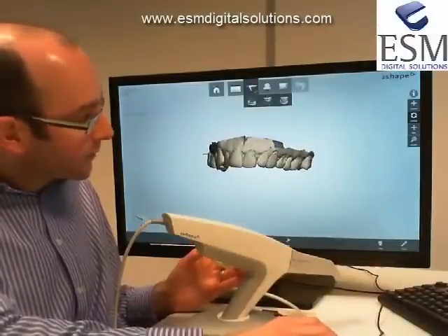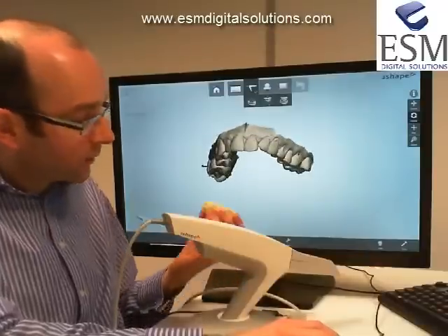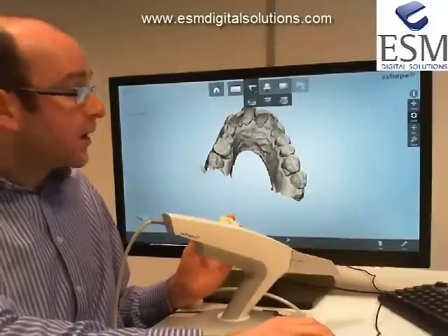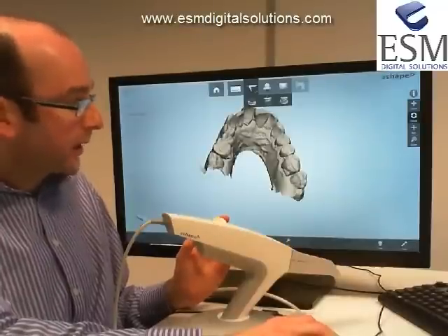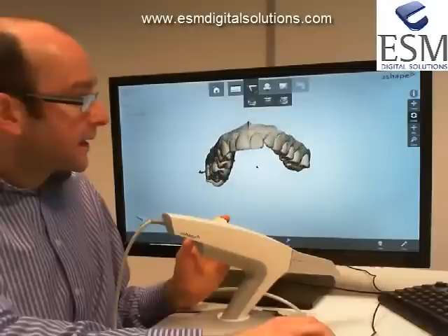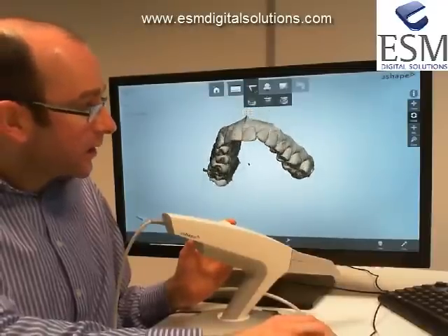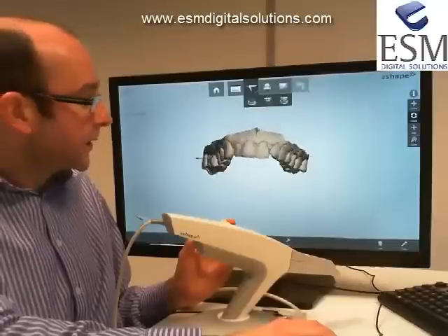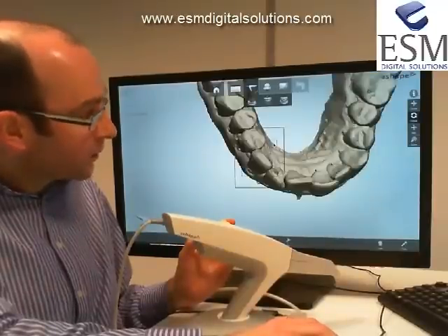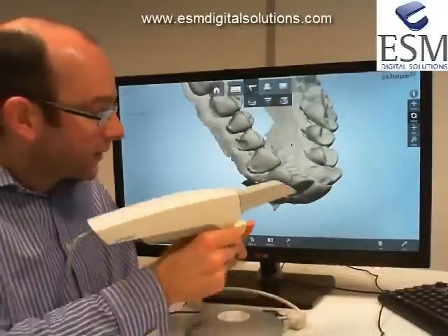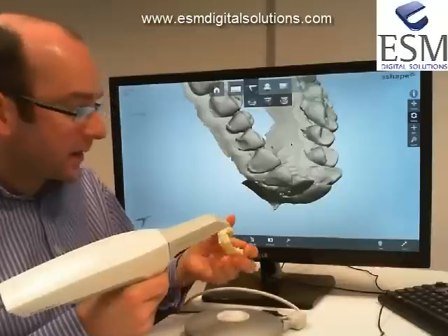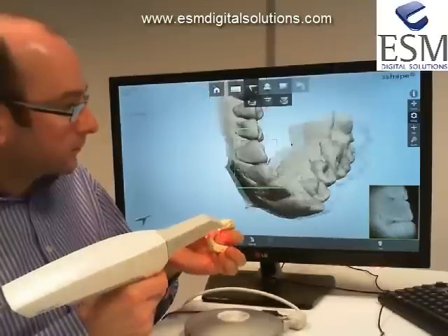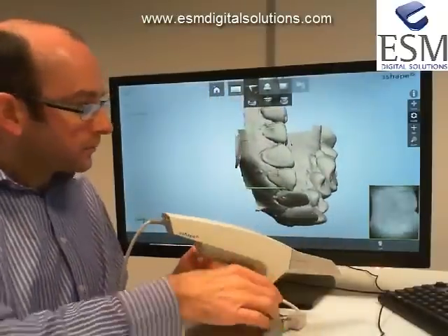How much detail and soft tissue do we need? This is really based on the reason for taking the model. If we intend making an appliance - for example a Hawley retainer - we'll need to capture more palatal detail. If it's an Essex retainer, vacuum form, or blow-down type retainer, we want to make sure we've got at least the marginal detail plus an extra few millimeters. In this case it would be worthwhile to go back in and re-scan an additional piece of detail just around here - highlight the tooth, capture the detail, and that's it.